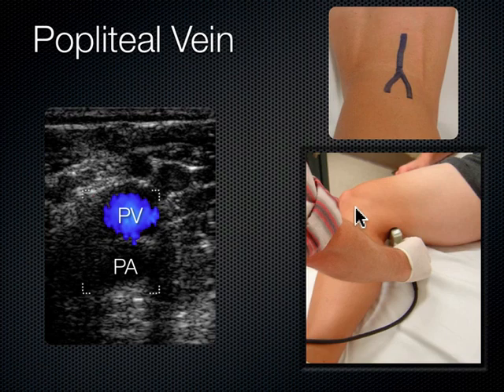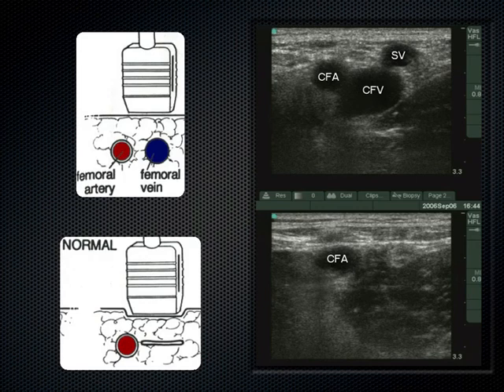What I do then is I just start compressing. As I'm compressing, I start to see blood vessels open and close. It's really an active technique — if you just put the probe on there and stand there and stare at it, you may totally be in the wrong place. If you don't start compressing, you may not be able to tell the difference between muscle bellies, nervous structures, and vascular structures. But once you start moving the probe around, the images start to jump off the screen at you.